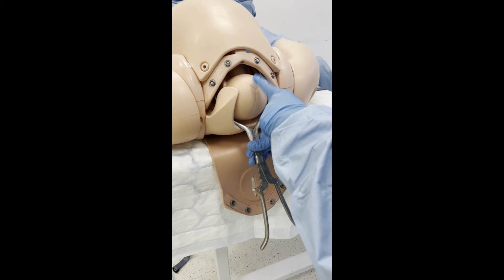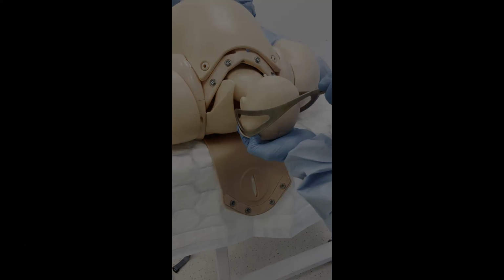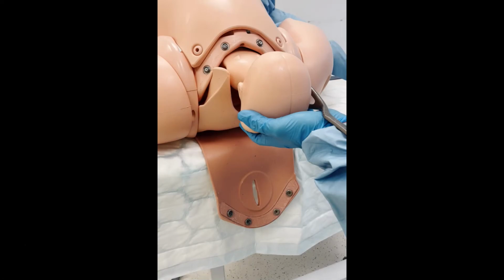When a contraction is present, apply traction in a direction to follow the pelvic curve, as with non-rotational forceps. Support the perineum and perform an episiotomy when the fetal head is crowning. Upon delivery of the head, remove the Kielland's forceps and finish by delivering the baby.